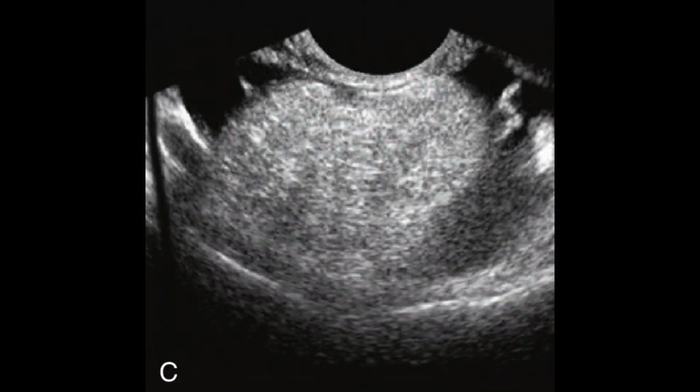This is a transvaginal scan, and on this transvaginal scan you can appreciate a highly reflective, large echogenic mass. Actually this is within the ovary, and the ovarian parenchyma has been replaced by this mass. This is dermoid cyst, this is cystic teratoma, and it is a quite common appearance. Clinicians know all these appearances because this is quite common.